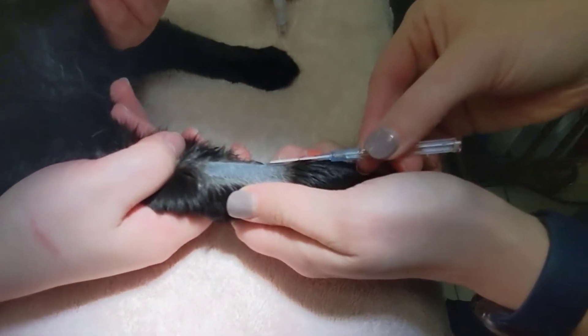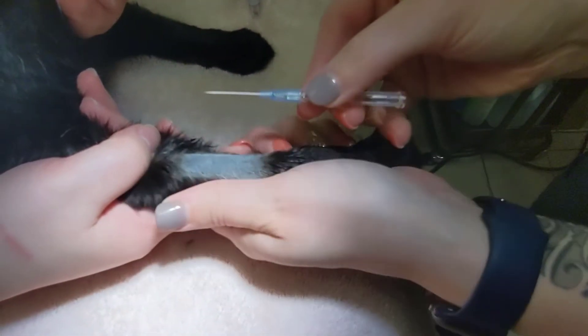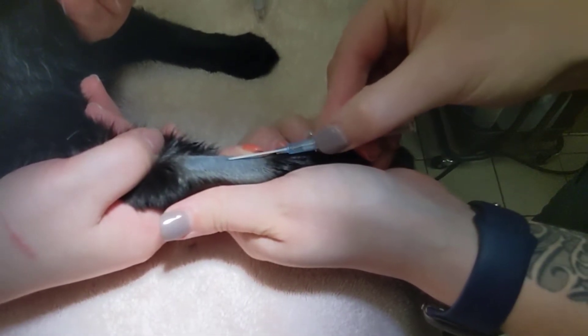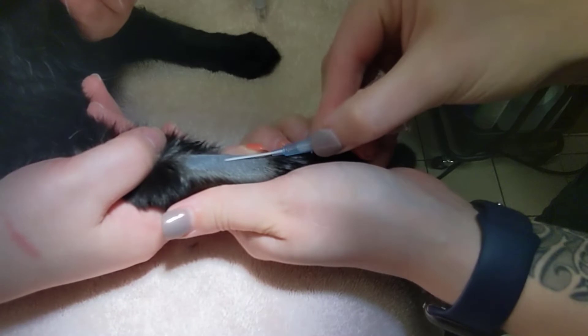Sometimes placing a catheter can prove difficult for even the most experienced of technicians. It is important to know some troubleshooting techniques for placing catheters in case things do not go perfectly for you.